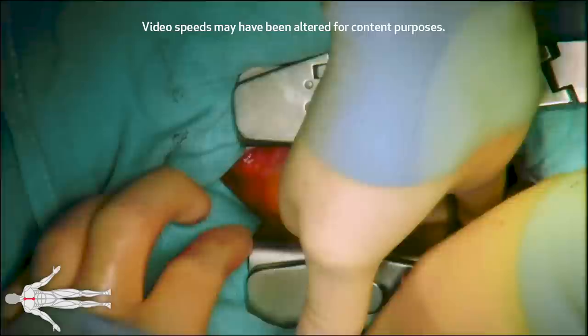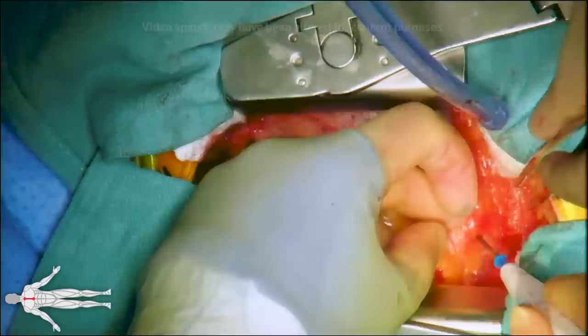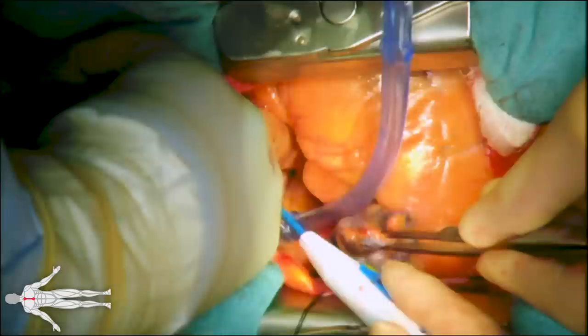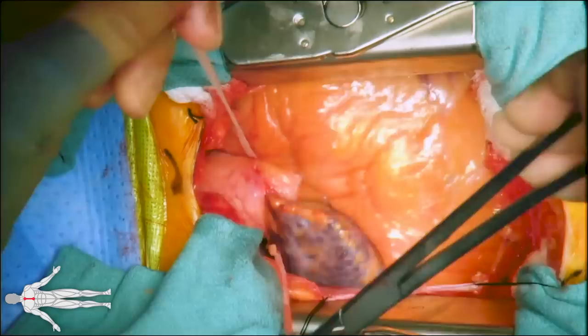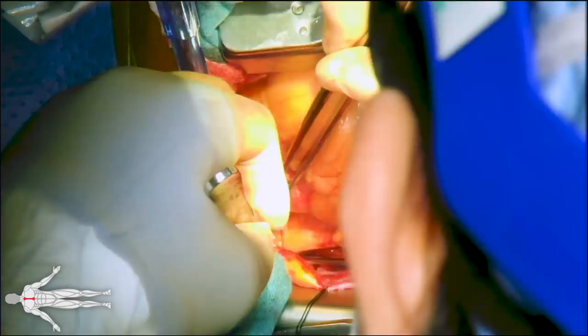The pericardium is visualized, the thymus is divided, and the pericardium is then incised open. The ascending aorta is then mobilized off the pulmonary artery. The ascending aorta is then dissected free, followed by passing an umbilical tape around it.